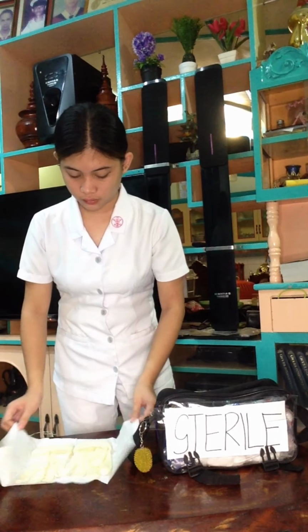First is sterile gloves. We need to put on our sterile gloves first to maintain the sterility.